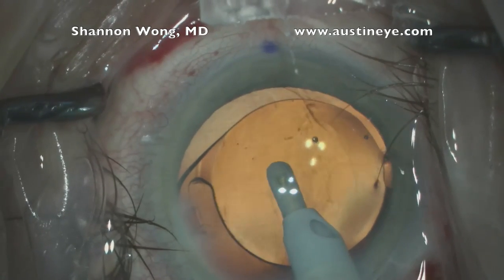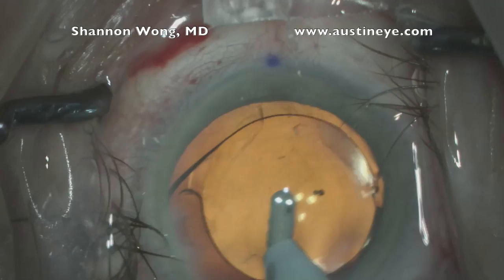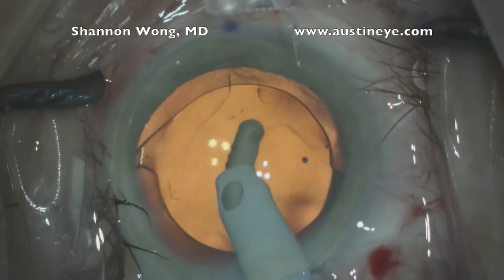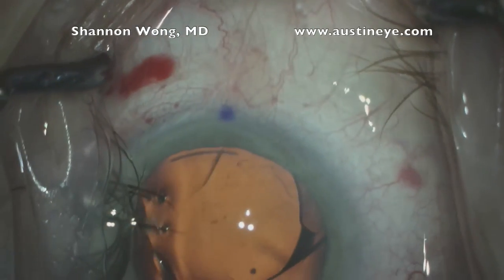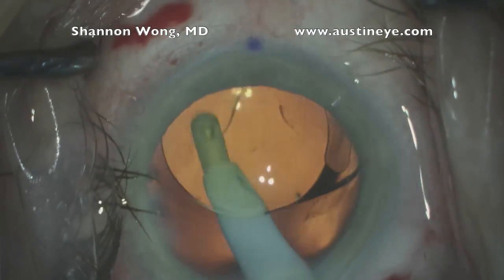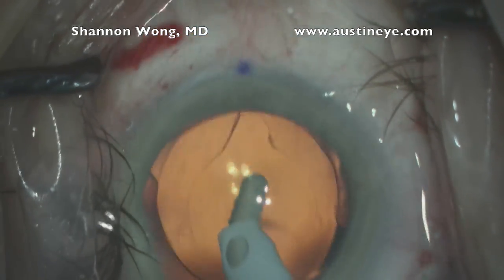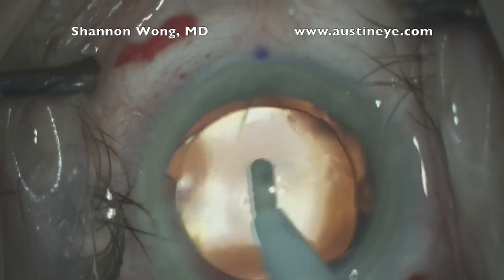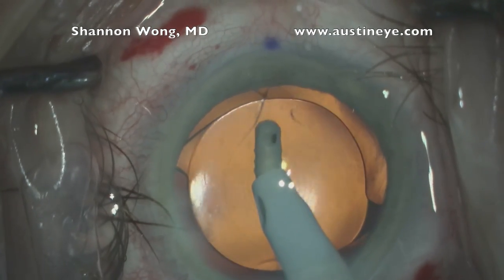As we remove the viscoelastic with the I&A handpiece, we go behind the optic to remove any residual viscoelastic. The lens centers very well and we use the anterior capsulotomy to center the optic of the lens underneath the anterior capsular leaflets.